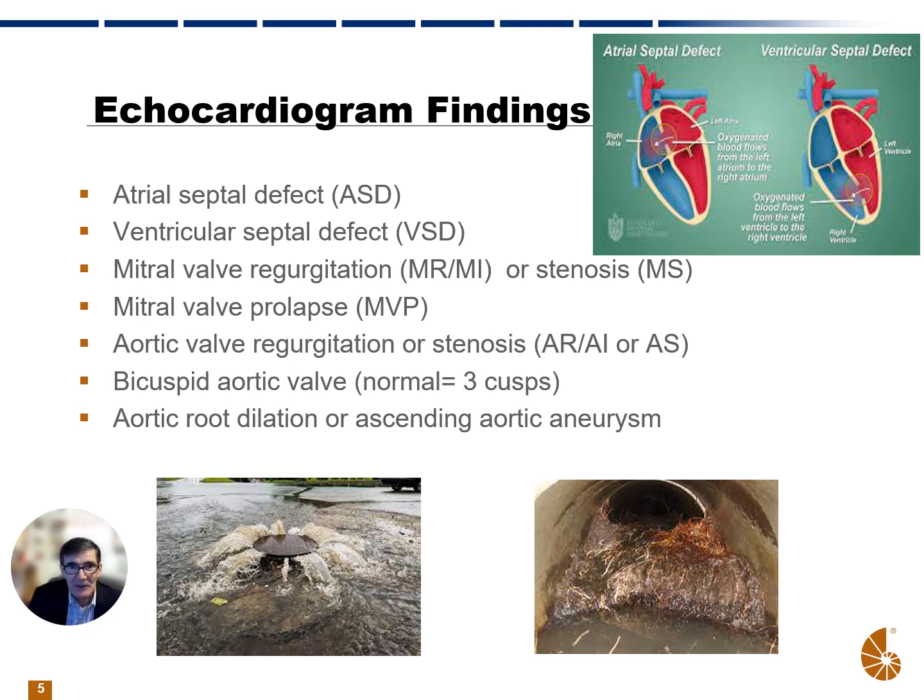So an echocardiogram is often used to assess whether a bicuspid aortic valve is present, and if so, it would be followed with an echo over time to see if there is any continuing deterioration of the aortic valve.